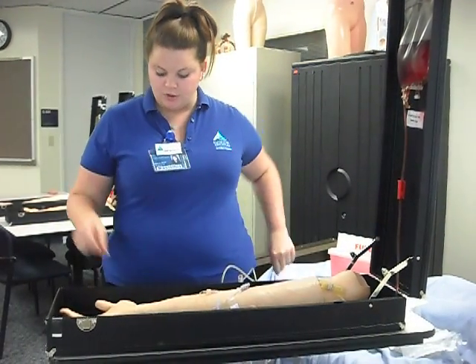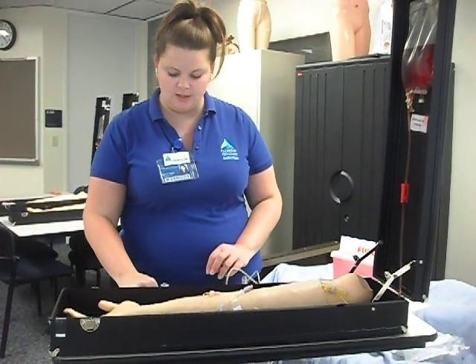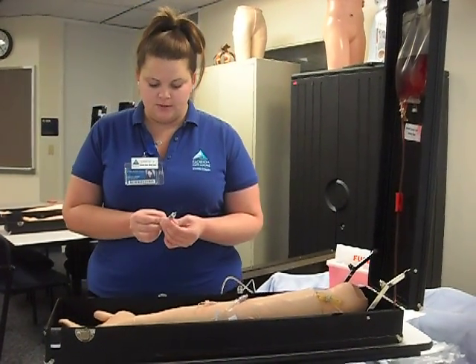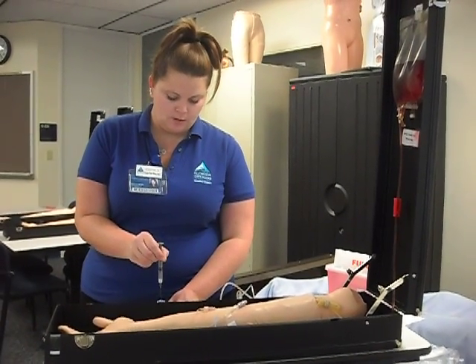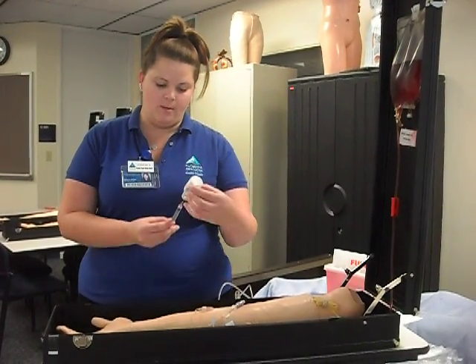So I am going to draw my meds. I'm going to check the date to make sure that it is in date, which it is, and I'm going to clean the top. And I'm going to take my needle and draw up air for the dosage amount, and I'm going to inject it. And inject the air. I'm going to draw up the same amount of meds.